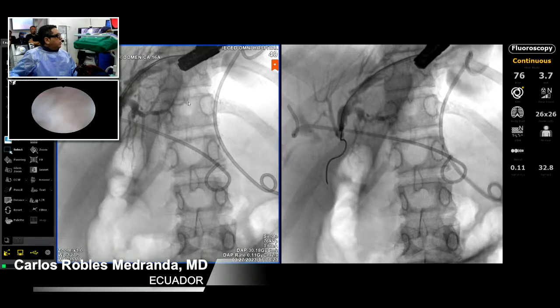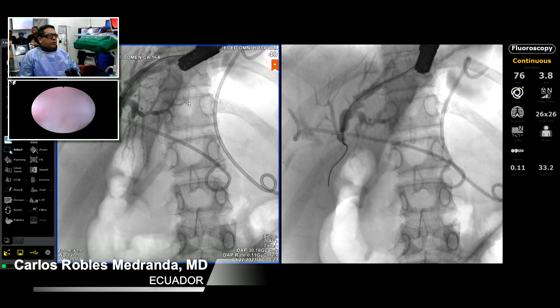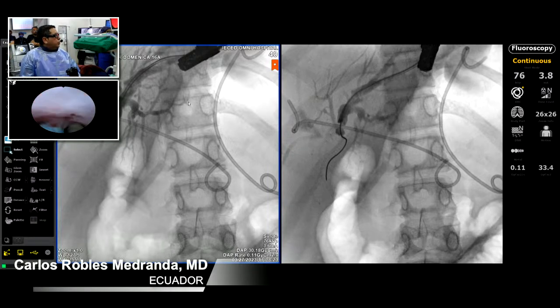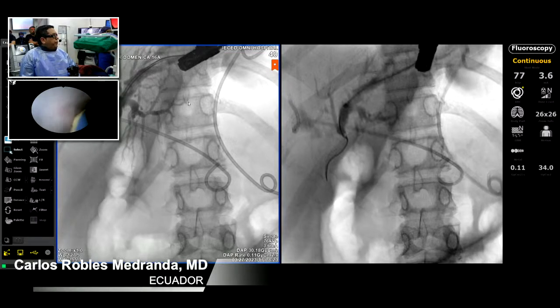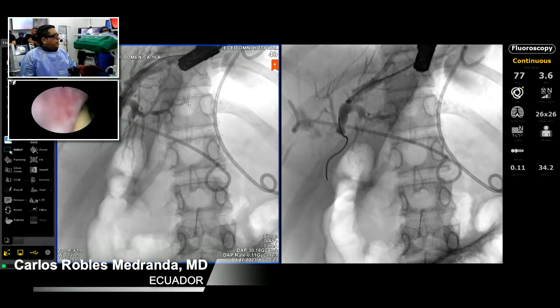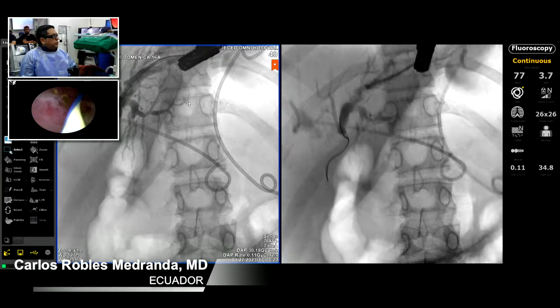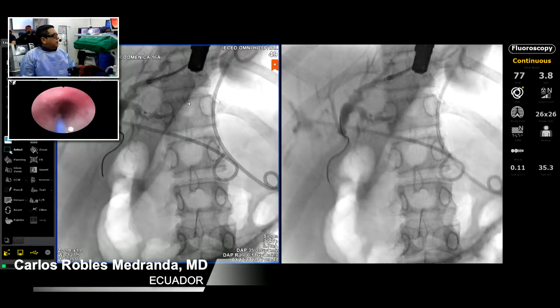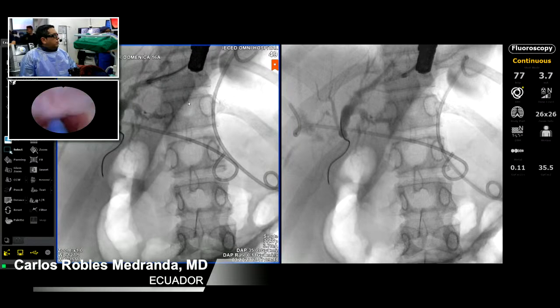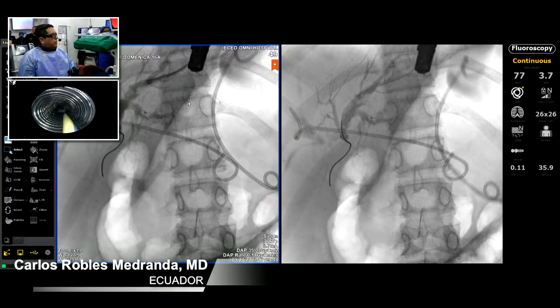So what I will do is to pass a sphincterotomy and to inject to see if this is or not. If not, I need to put a stent between the left and the right biliary tract, and then to send probably to surgery this patient. The other solution is to use magnets. Okay, let's see if this was anastomosis or not. If I have the chance, that will be fantastic because I will recover the anastomosis.